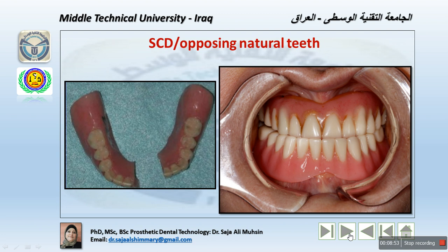Now, the labiolingual thickness of the anterior wax occlusal rim will interfere with establishing the correct vertical dimension of occlusion, if the future anterior teeth arrangement will require vertical overlap. Now, the anterior lingual portion of the maxillary anterior wax rim must be made thin. This is in order to allow the lower incisors to produce the correct vertical overlap for establishing the correct vertical dimension of occlusion, which will be less than the vertical dimension of rest.